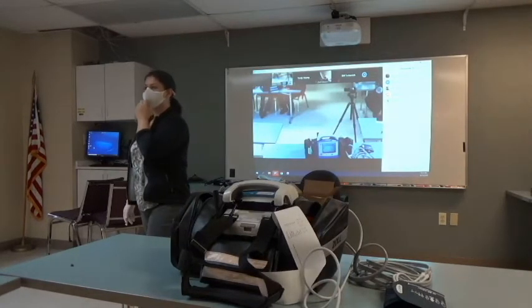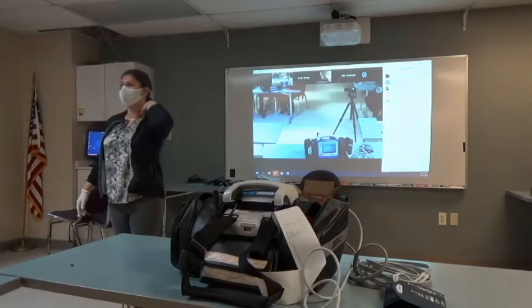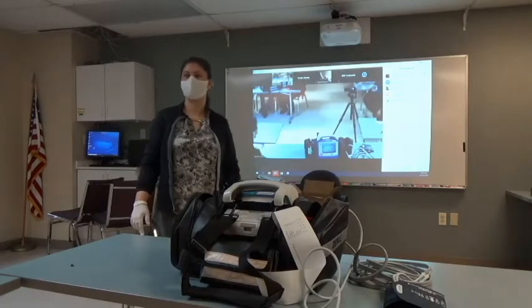When you bring that list up, is that different patients, right? Yes, it is. That's the storage file from the home button. Is there a way to look at their names on that or just the times? No names.